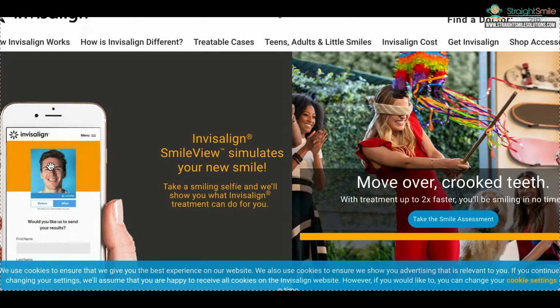And of course, I didn't see the terms and conditions that the patients get, because in order to see them, you have to be a patient, and I didn't have access to that. So to me, that was like, yikes, yikes, yikes. No, thank you, I don't want to do this. I'm just telling you that the option is out there. I don't think I'm going to use it with any of my patients, to be honest.